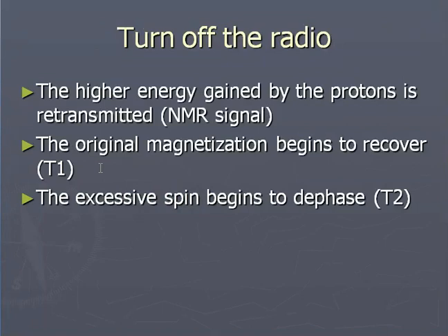Now, once the protons are at higher level due to the application of the radio frequency wave, when the radio frequency is turned off, the high energy gained by the protons is transmitted as NMR signal.